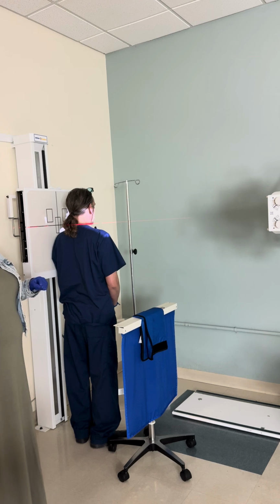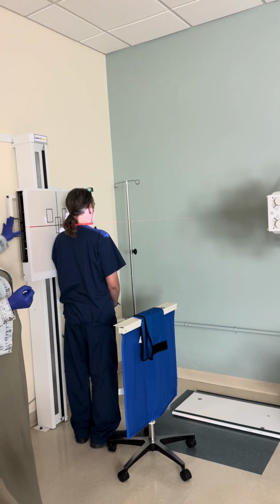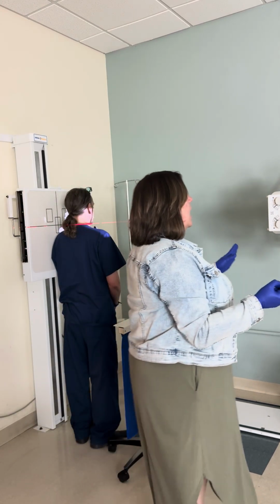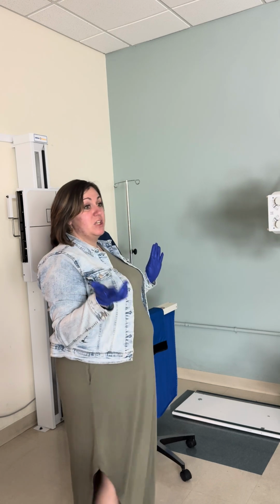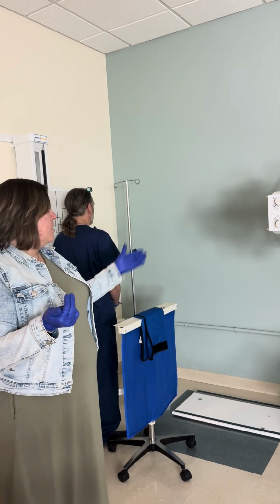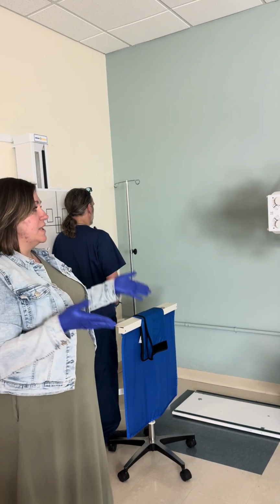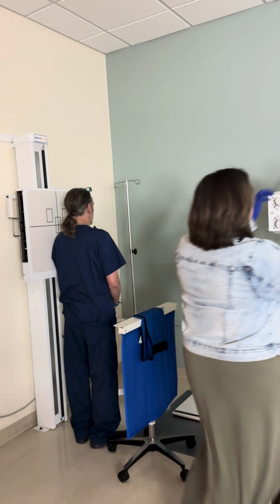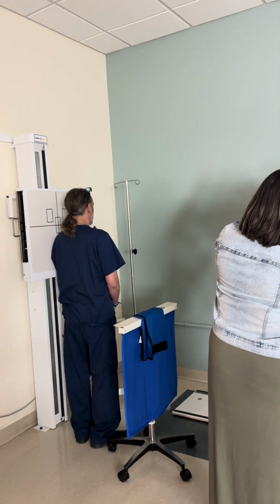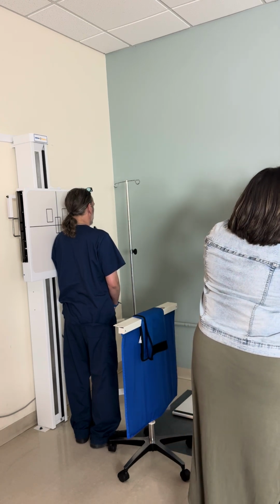Now for the T-spine, we're gonna go ahead and start with our swimmer's view. So our swimmer's view is a 10 by 12, so I'm not gonna change that. The book says between 60 and 72 inches for SID. We're gonna use 72 for practicum because I don't have a 60-inch marker on the floor. Okay, so we'll just leave it at 72 and that's fine. We're going to do a 5-degree caudal angle. So just a little baby bit, 5-degree caudal angle, okay?